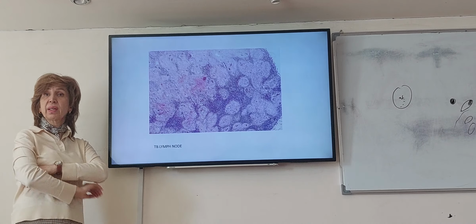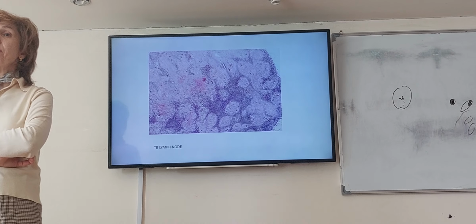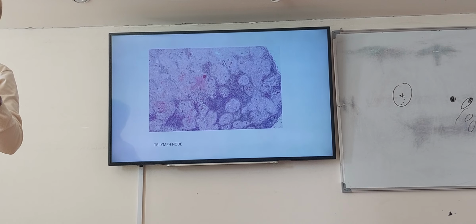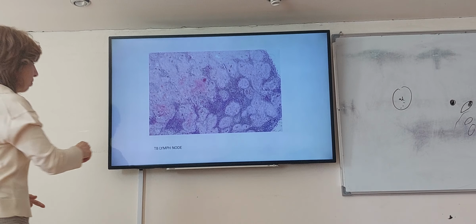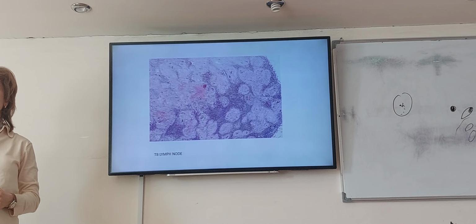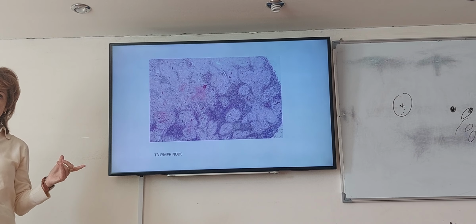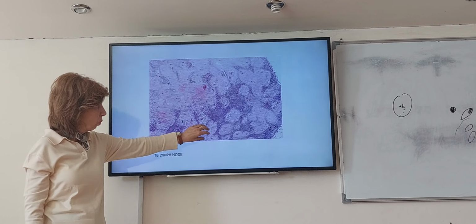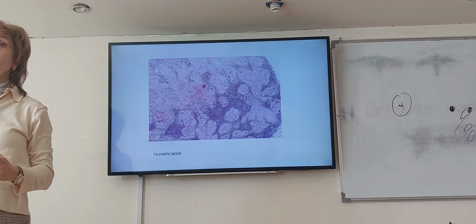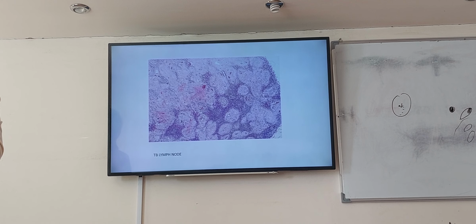Eosinophilic nodules. Sometimes these small nodules can unite together, and I will have something like this, a very big area, a very big granuloma. So it can be small ones, and sometimes they unite. You can see only one also. So be cautious.